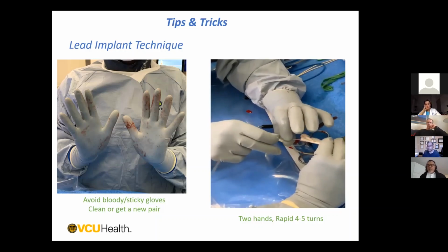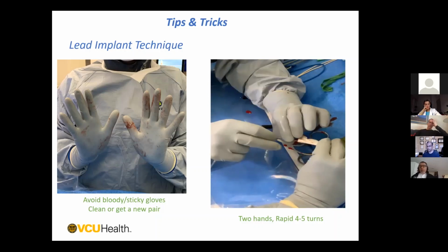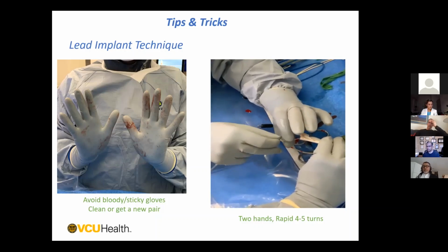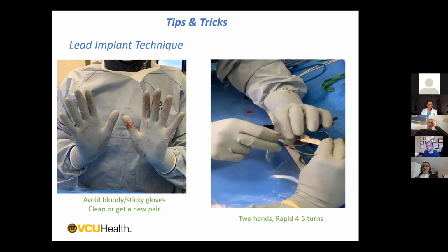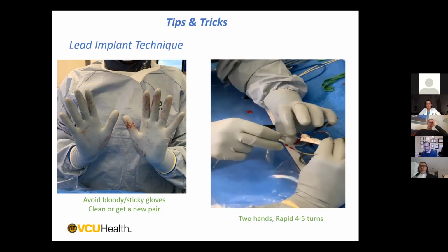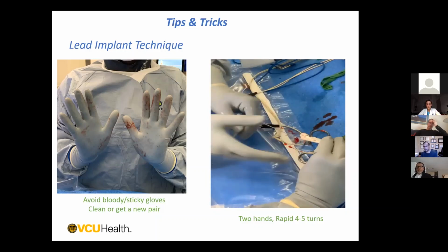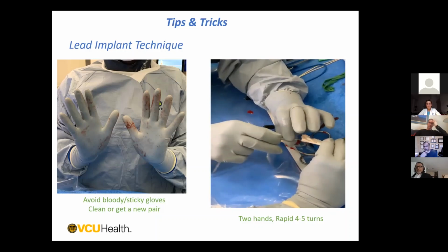Yeah, that's a great point, Felix, that if you're hitting a lot of resistance and you have a very fibrotic septum, it is probably a good idea to just change your position. And not only change the position, but remember to bring back your lead and clean the tissue out of the helix. Because if your helix is full of tissue biopsy, then it's not going to be able to dig into the tissue. I actually like this idea.